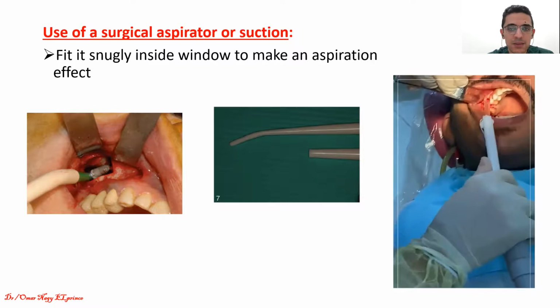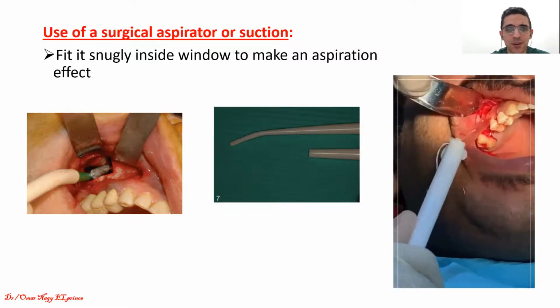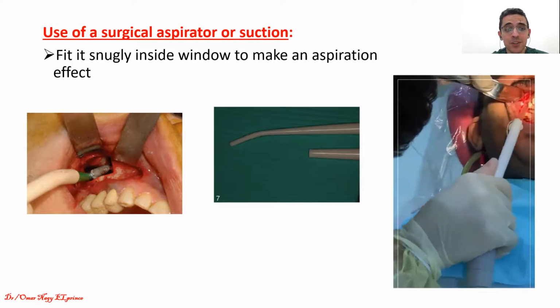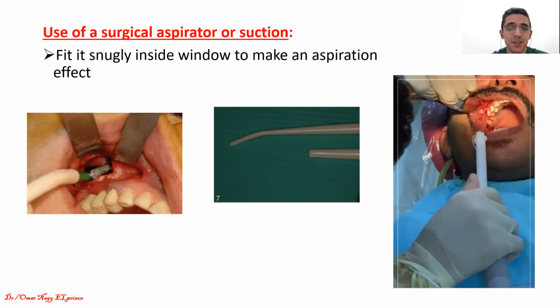You don't want to depend only on this. Of course, there are many things that you can do, many tips and tricks as we are going through them. But this is one of the most robust things that you can do, or the thing that can really help you to retrieve the implant.